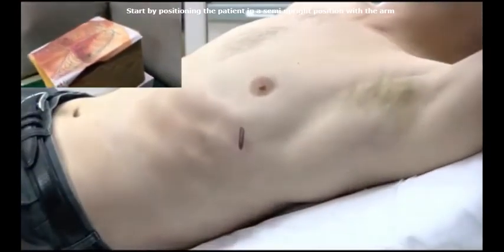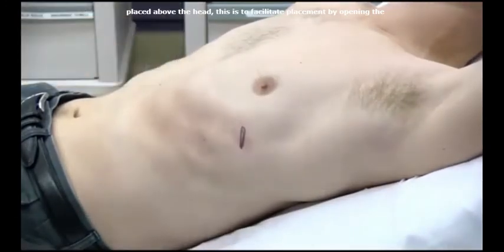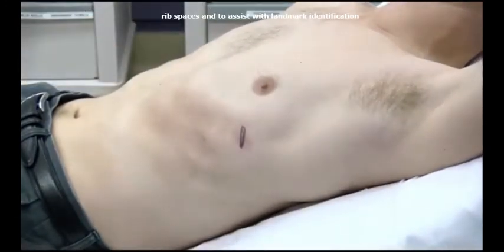Start by positioning the patient in a semi-upright position with the arm placed above the head. This is to facilitate placement by opening the rib spaces and to assist with landmark identification.